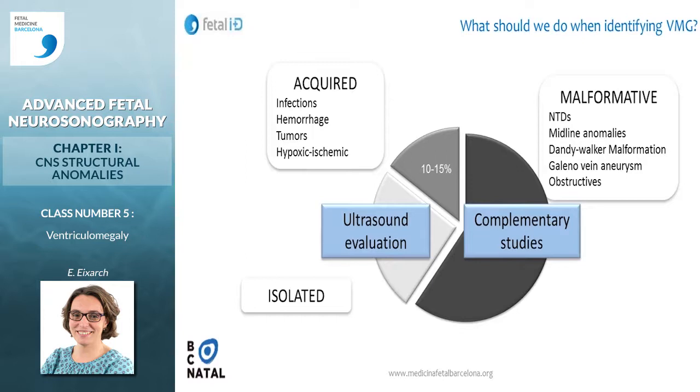And how can we differentiate the different causes of ventriculomegaly? By performing a complementary study and a detailed anatomical study. The ultrasound evaluation will help us to identify the cause, and the complementary studies will help us to confirm the pathology.